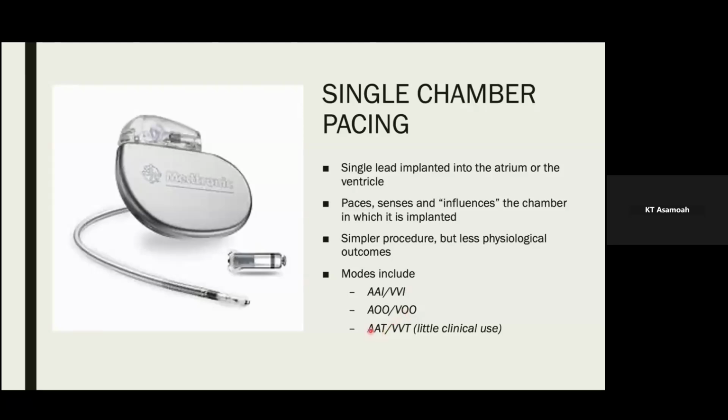Then AAT, pace atrium, sense atrium, and when you sense, it triggers pacing. And then VVT, pace ventricle, sense ventricle. When you sense, it triggers.